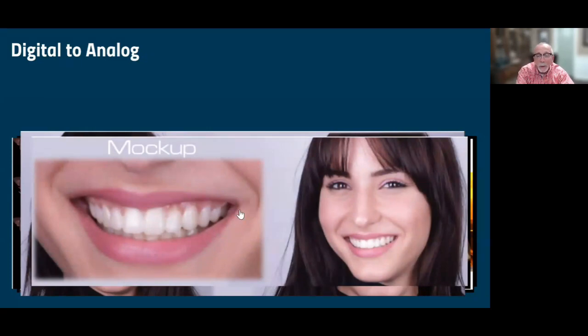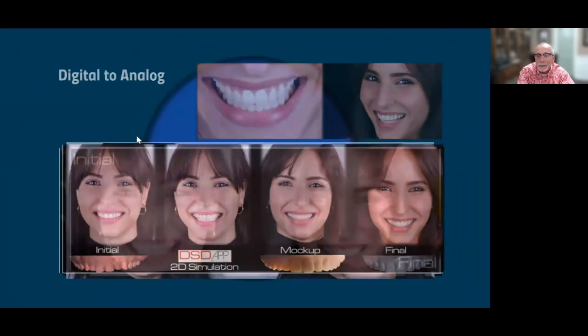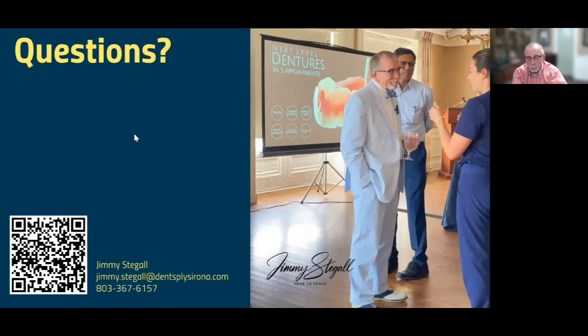So this patient got to go home for a couple of days and wear this mock-up, and then came back. Of course, he sold that case. She was in love with it, and moving to the final is pretty easy because we already have the data. And if you make any tweaks in the mock-up, we can scan that, integrate that with the design, and move to the final. So doing that digitally just makes it so much easier, faster, and better.